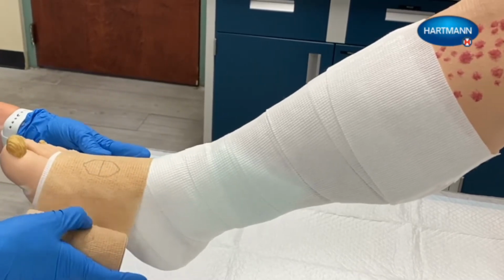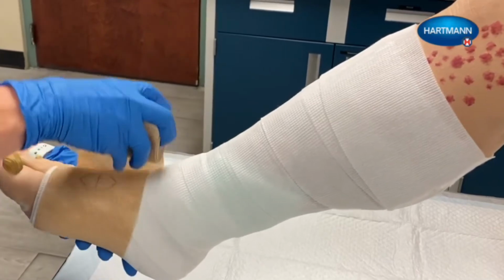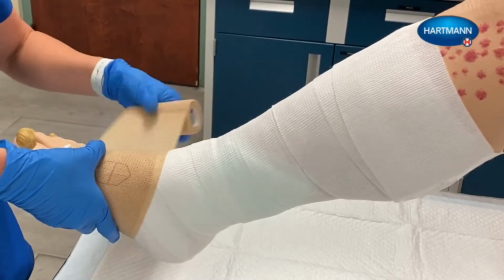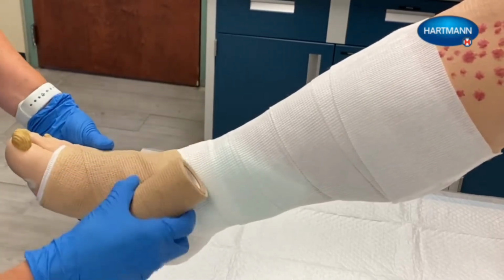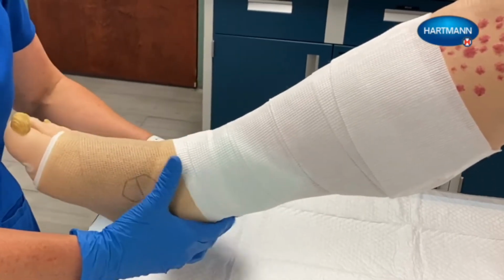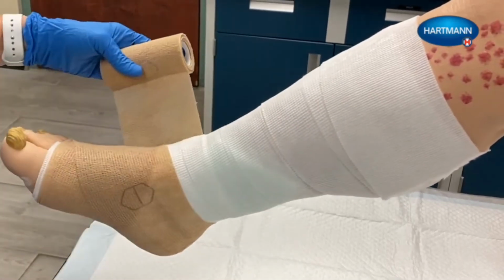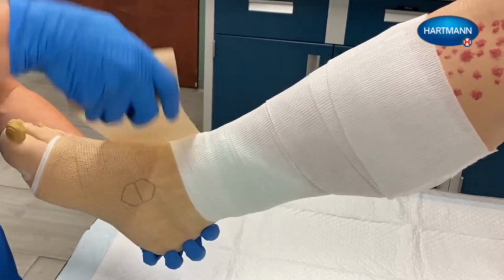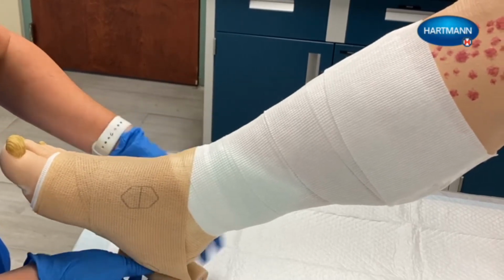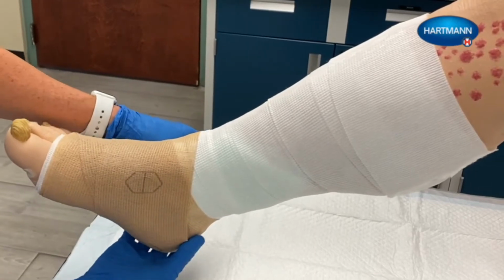As with the padding bandage, start applying the compression bandage proximal to the base of the toes. After 2 turns for fixation, wrap the bandage around the back of the foot and enclose the heel using a figure 8. Wrap the foot without stretching the bandage and do not yet follow the printed indicator.